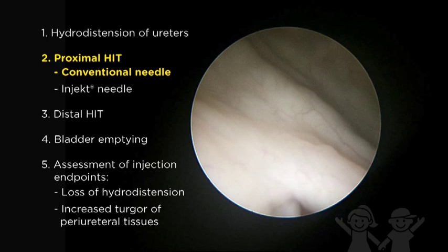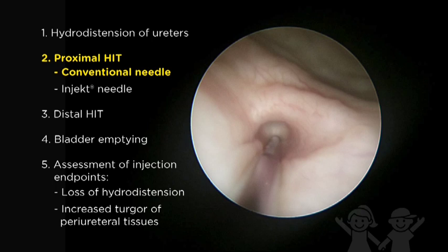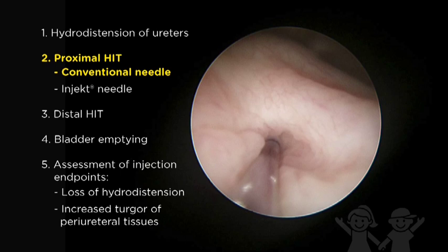When employing the double-hit methodology, the needle is placed into the ureteral orifice and inserted in the mid-ureteral tunnel at the 6 o'clock position during hydrodistension. Once the needle is in place, the scope is placed at the level of the ureteral orifice, allowing for the position of the needle to be assessed. The needle is inserted to approximately 1–2 mm.